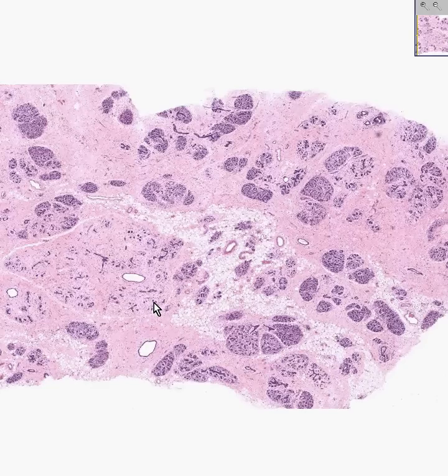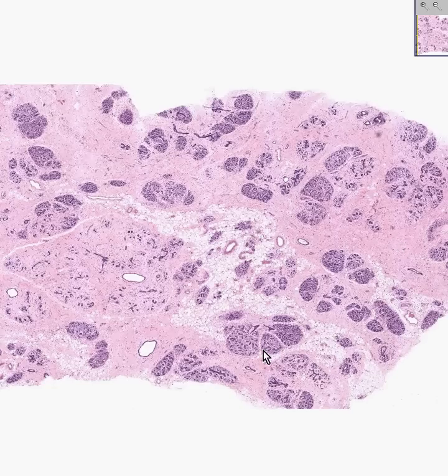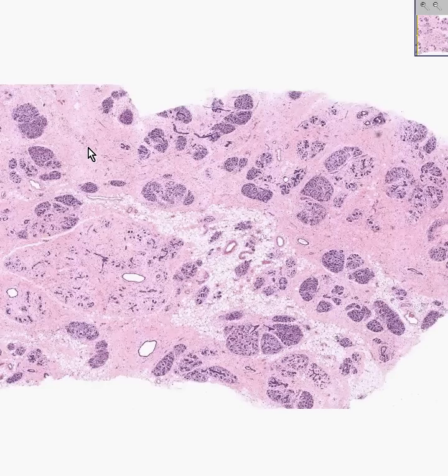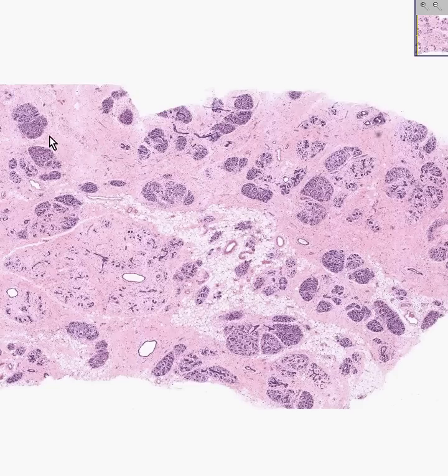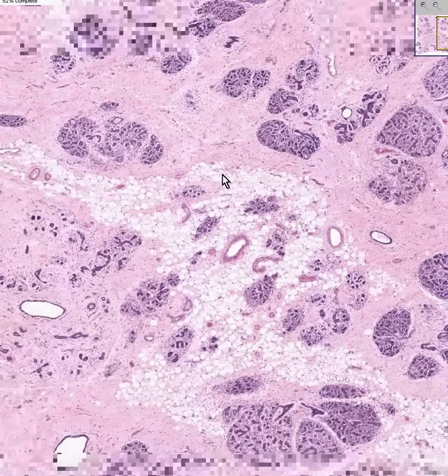The rule of thumb is that if the stroma is about the same or even more abundant than the lobules, this is probably a woman who is not producing much milk. This could be somebody who is postmenopausal. The more postmenopausal you get, the higher the ratio between the stroma and the glands or the lobules.